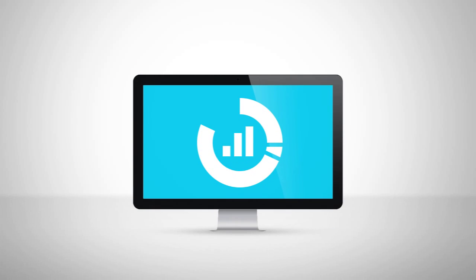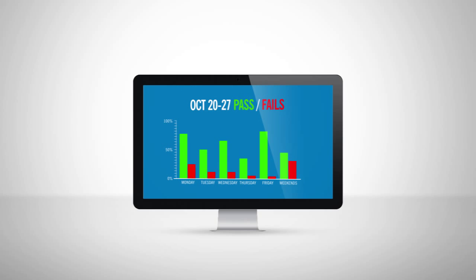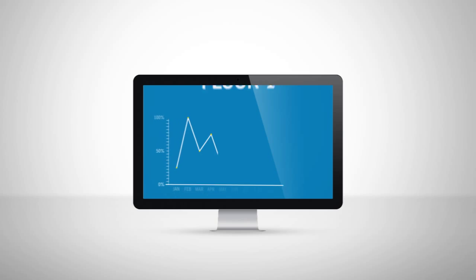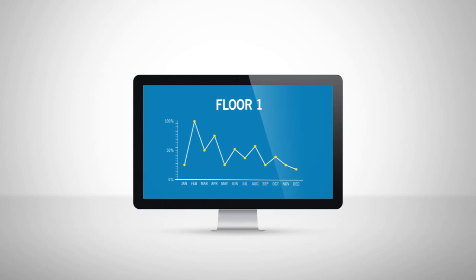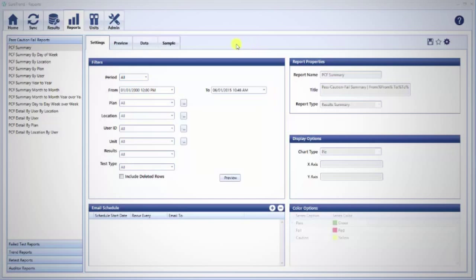The Reports tab is the most useful and powerful component of SureTrend software. Here you will generate reports and graphs for trend analysis, problem solving, personnel performance evaluation, and record keeping.